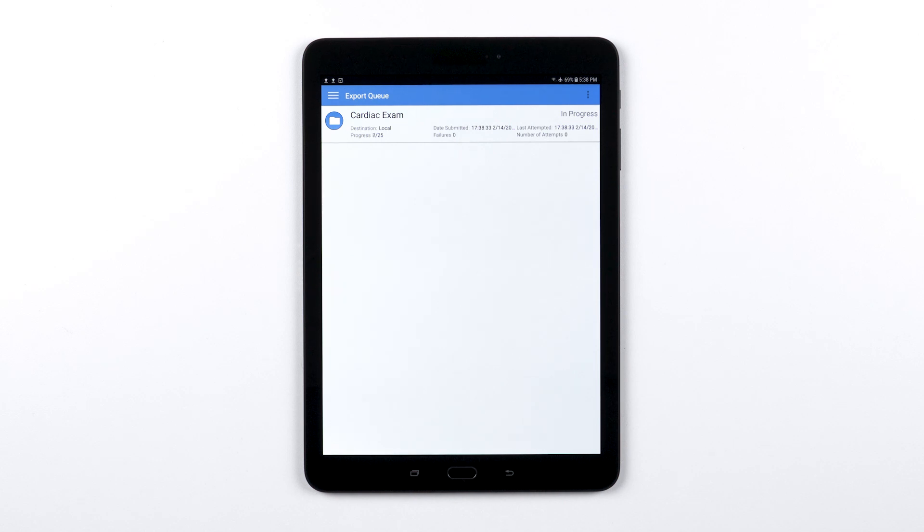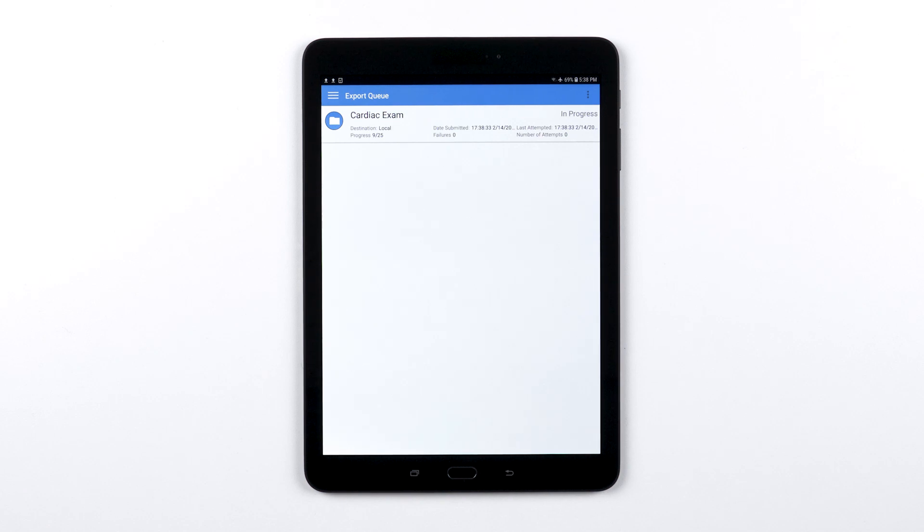If you've exported your exams to a DICOM server or network share location, those images will be transferred to that location wirelessly.